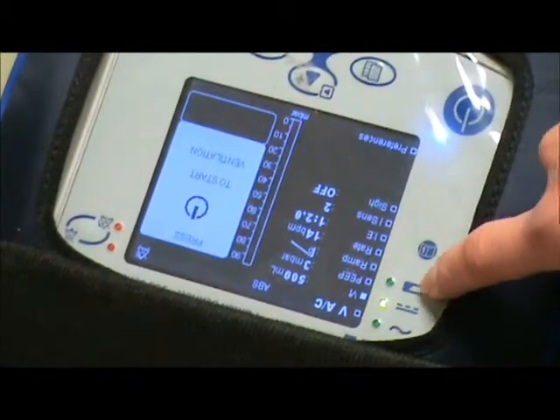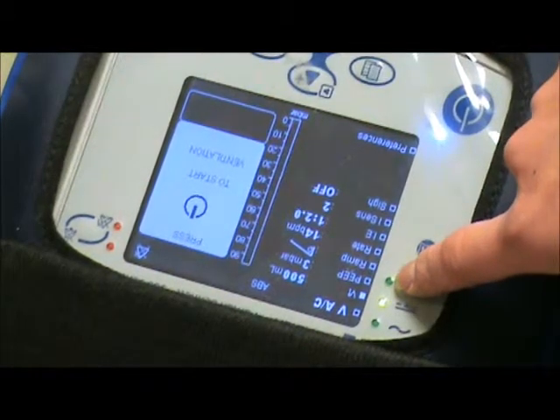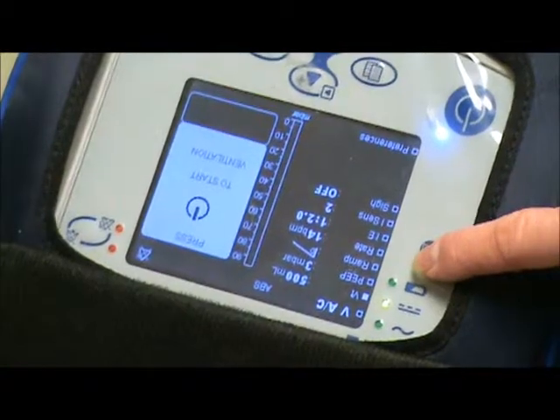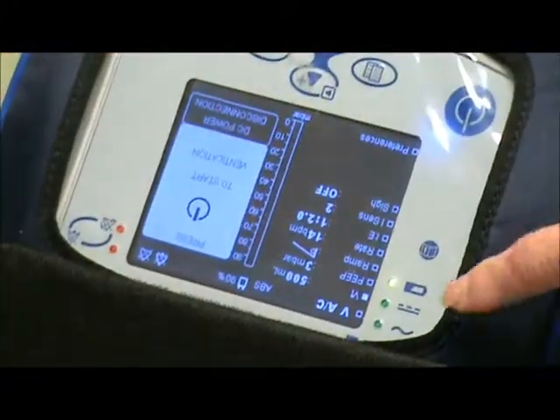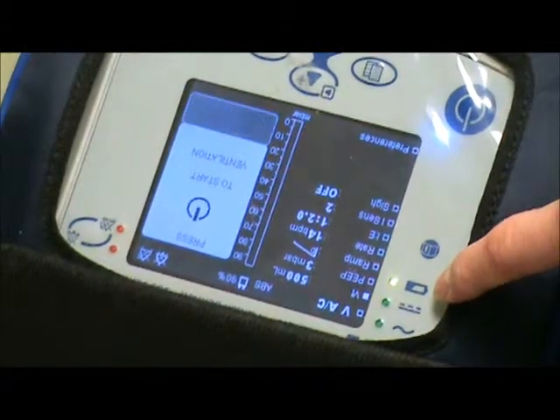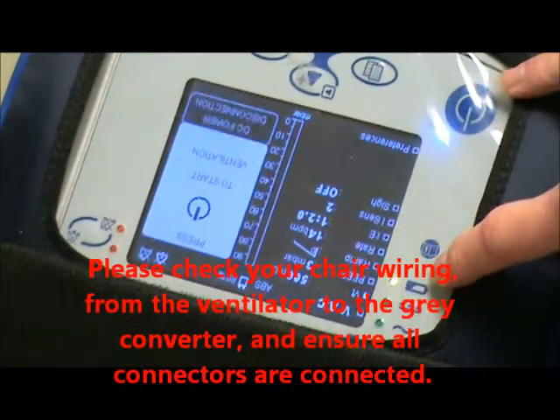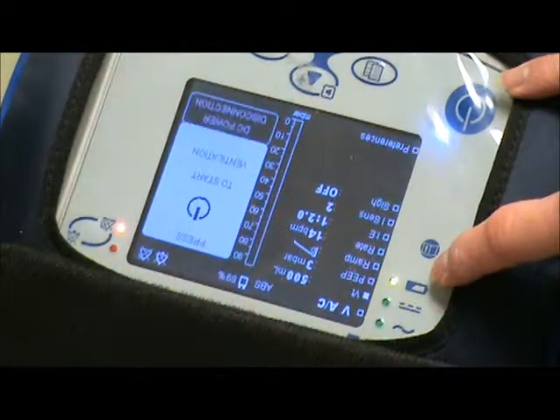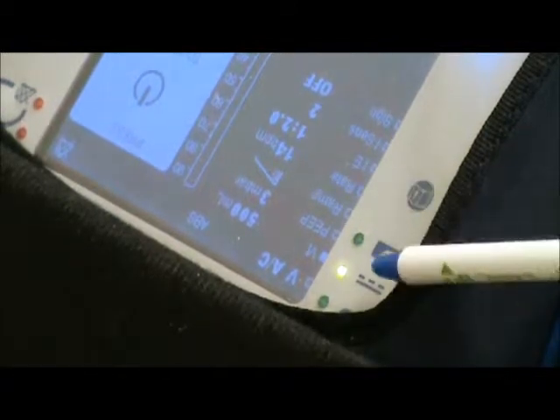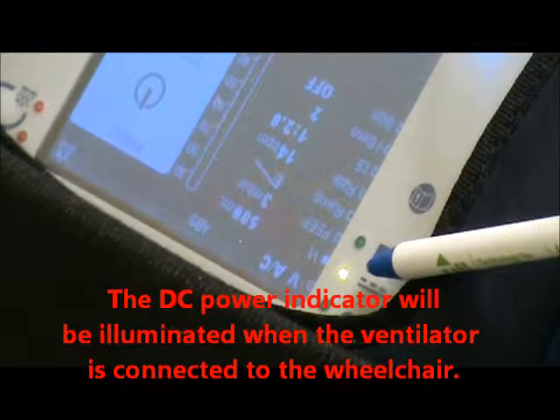The third light with the battery symbol tells you that the machine is running from internal battery when the light switches to that indicator. So now the machine is running on internal battery. If your machine is connected to the wheelchair and the battery indicator lights up, that's telling you the wheelchair battery is not connected or there's something wrong with the wire on the wheelchair.